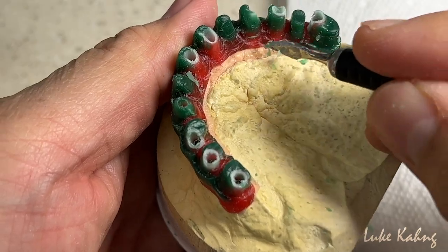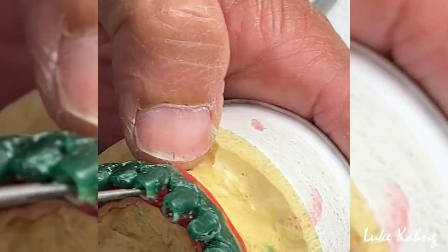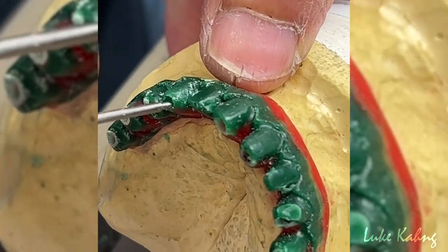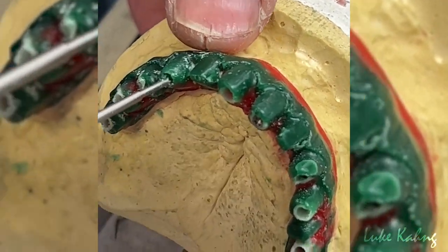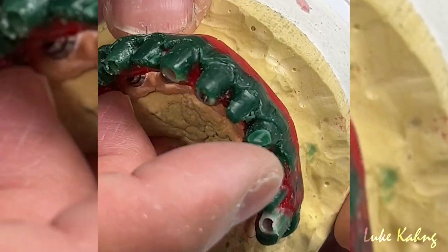I'm going to grind here more too. We're talking about the pontic, so we're going to decide what we should do with it. Let's see the pontic.